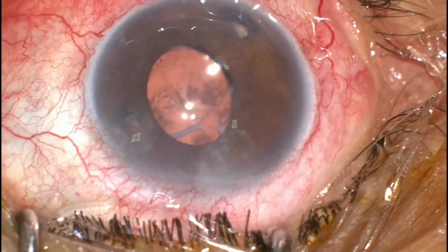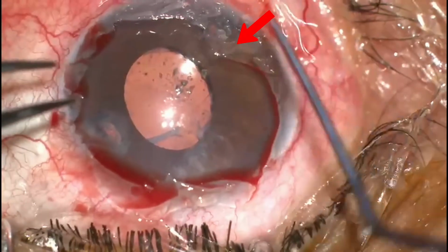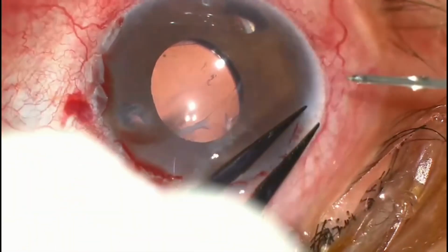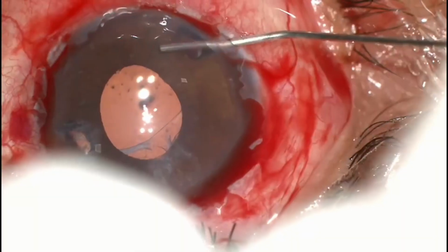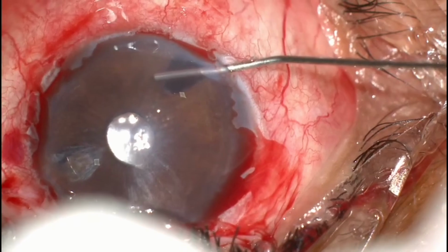Now, when you start off with a PDEK, initially we try to remove the epithelium for better visualization over here. And in this patient, if you observe, there are iris atrophic patches and you also have a large area of a gap inferiorly. So initially we try to put in pilocarpine just to see how much the pupil constricts.